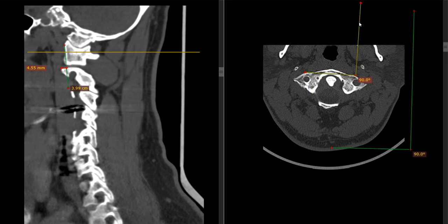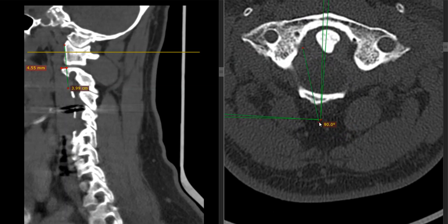I'd be curious if you have any rumbling noise in your right ear. So I'm just judging to see whether or not this lines up. And so here's where I would say you have a slight C1 skull rotation, but this could be just how you're laying in the machine. So what's the number? It's just about a 1.9 rotation, which is nothing to even complain about.